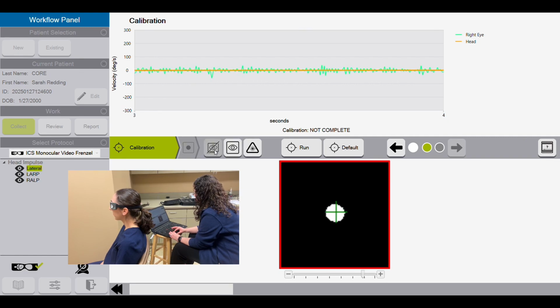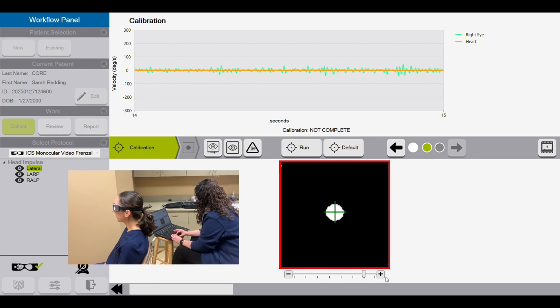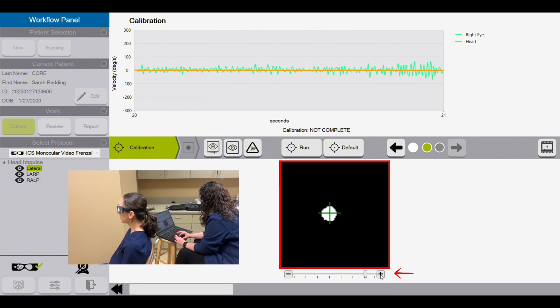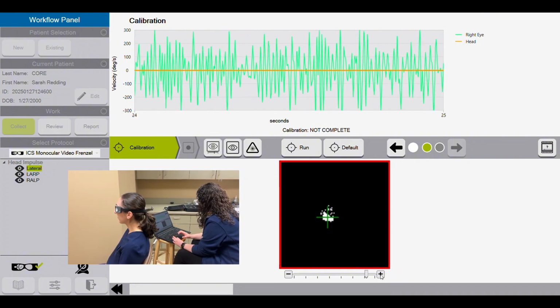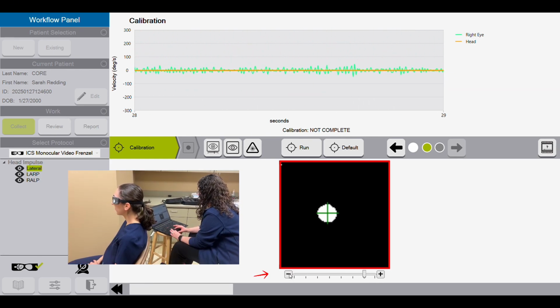This first button here, we're going to see it's called Enable Manual Thresholding. So if I click that button, it opens up this scaling box here underneath that bottom box, scaling kind of like a number line timeline. If I hit the plus sign, it adds more darkness to the video, to the recording, to whatever's in the box there. And if I click the minus, it's going to add more light. This is your contrast basically.